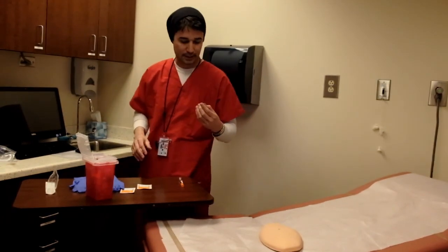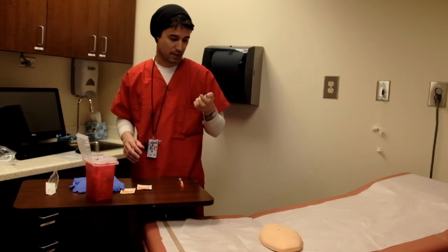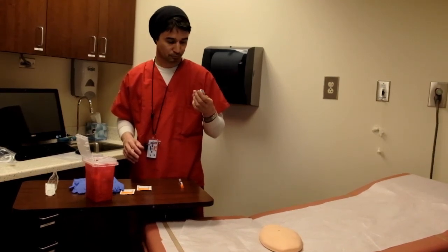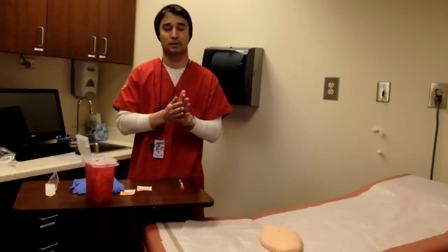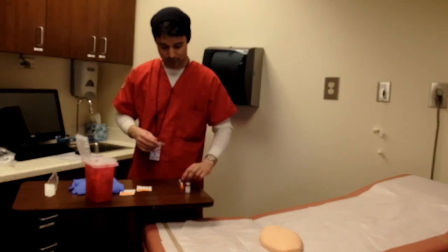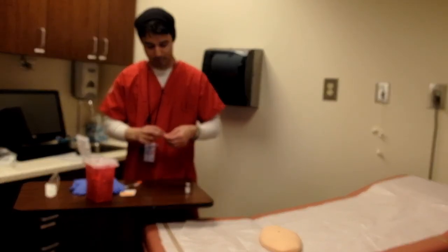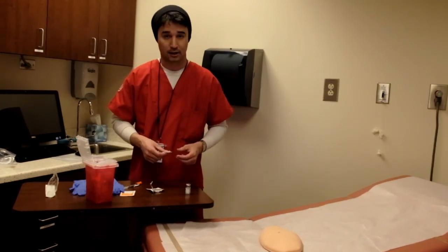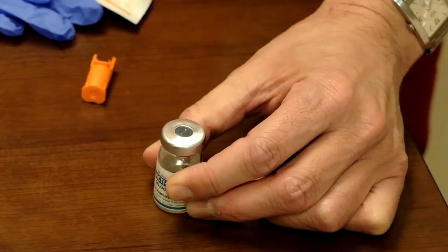In this particular case, we have a bottle of heparin. Normally this is done with insulins, but I'll go ahead and flip it over and roll it in my fingers. Let's get that mixed up properly. And we'll wipe off the top of this vial. It has a little rubber stopper on the top. We'll wipe that off and get it clean with some alcohol.